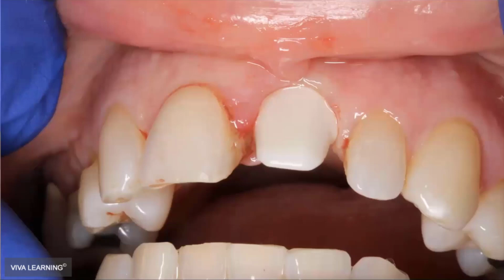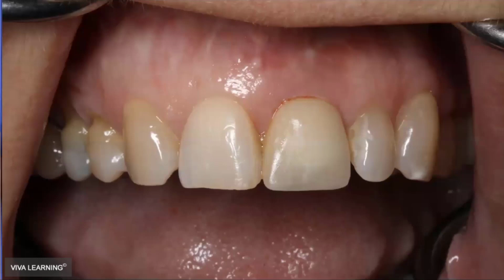So then I put in my split crown. For you guys that use CEREC, you're probably familiar with, you've got screw retained crowns, and then you've got crowns that you can split into a custom abutment, which is what this is. And then the cement retained crown that will glue on top of this. So this is kind of her final crown.